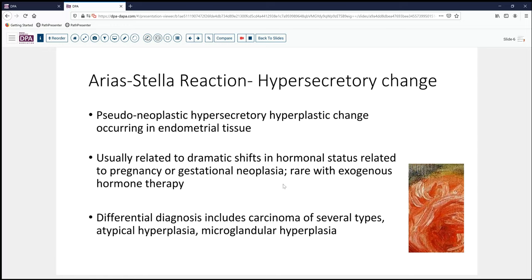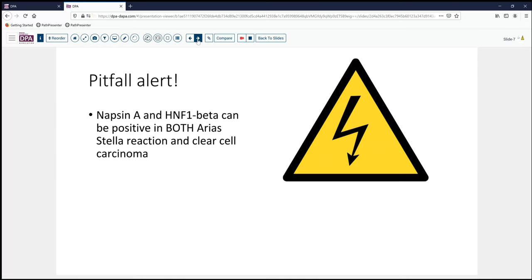The differential diagnosis includes hyperplasia and several types of carcinoma, as well as microglandular hyperplasia. One significant pitfall to be aware of is that if we're thinking clear cell carcinoma because of the clear cytoplasm, nuclear atypia, and prominent cell membranes, Napsin A or HNF1-beta will not help us because both of these will be positive in both Arias-Stella and in clear cell carcinoma. So don't be tempted to resort to immunostains to prove benignity. Go with the clinical history, the morphology, and the age of the patient.